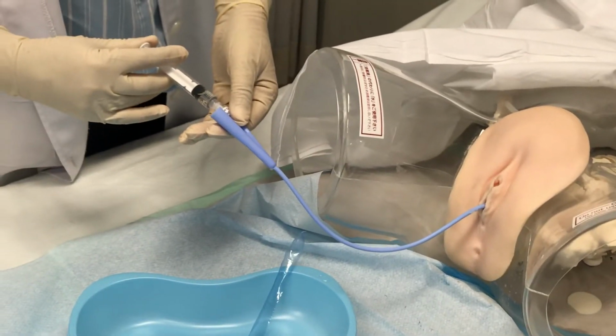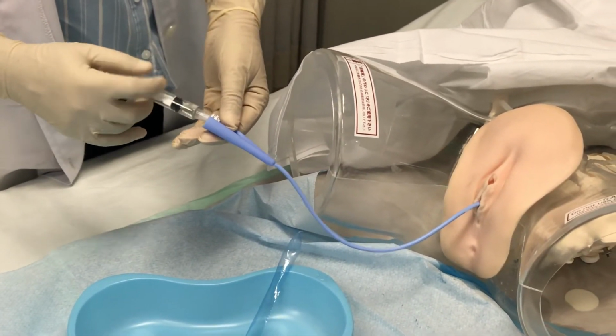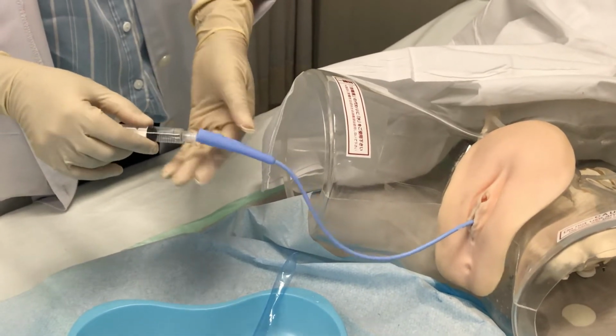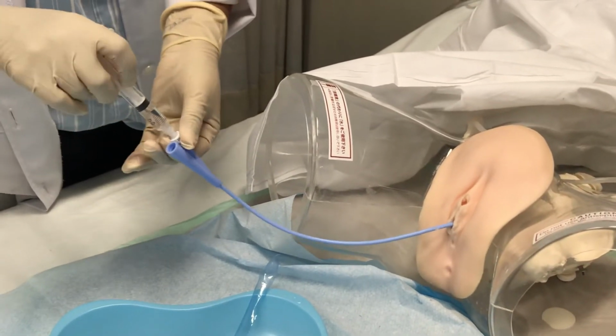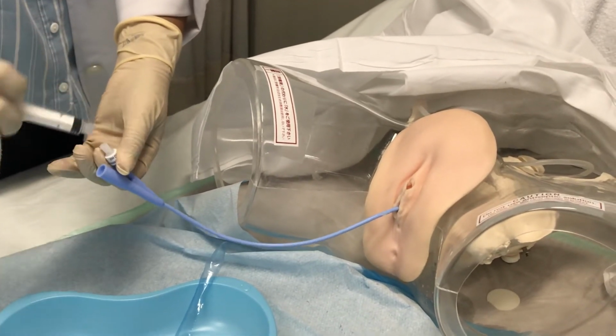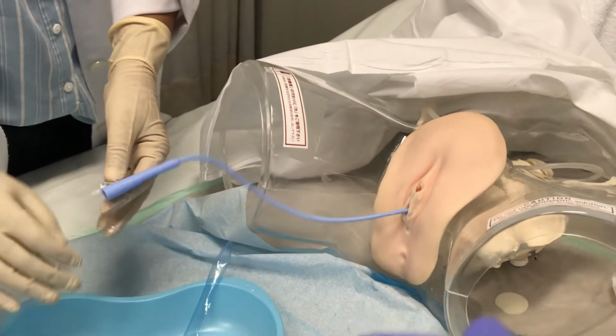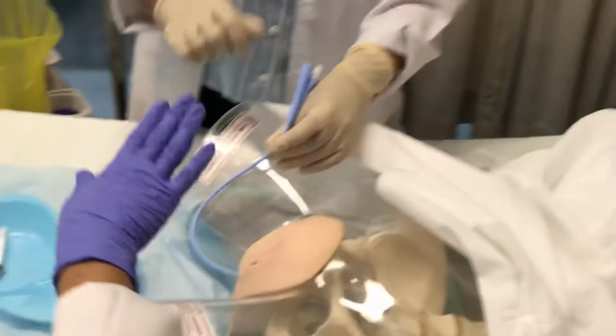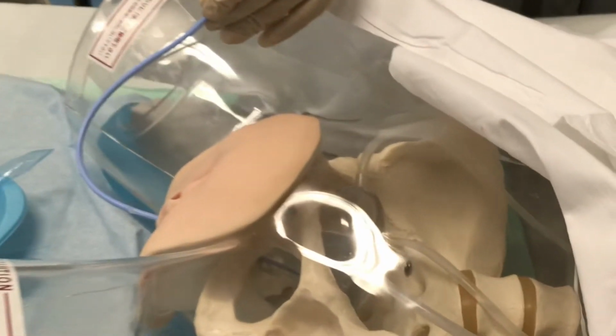So when we are deciding to remove this, we need to remember how many ml we inserted. When we keep the syringe, whatever is there inside will come out automatically. So now the next step is connecting the bag.